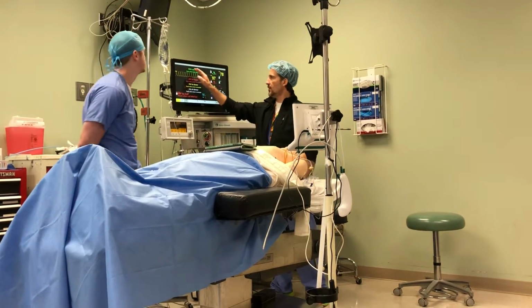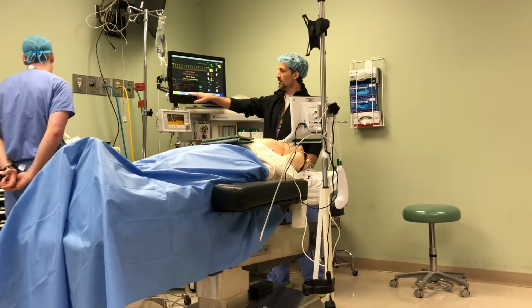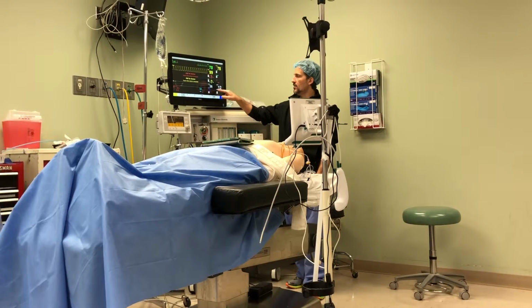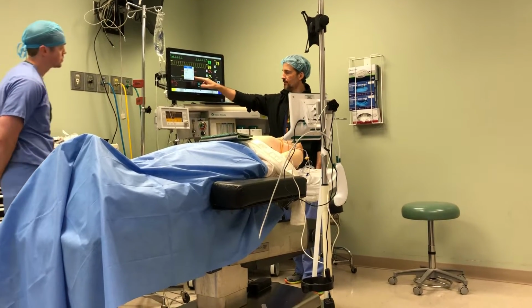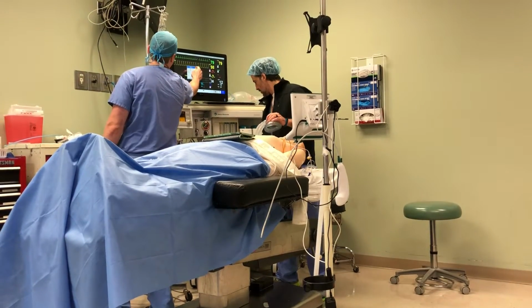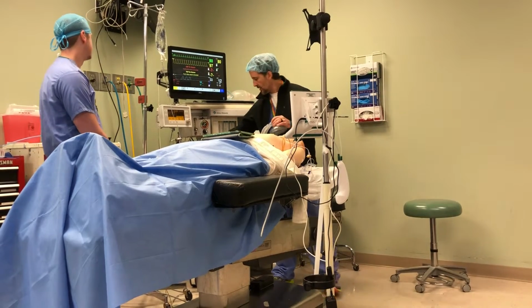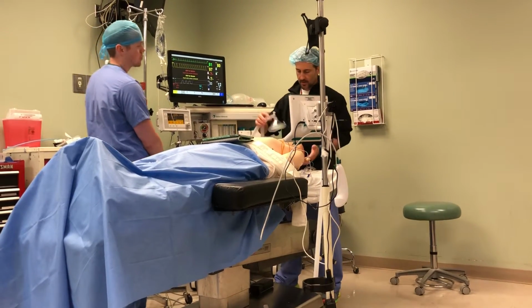So I'm verbalizing, I want EKG, end tidal CO2, I want a blood pressure, and I want end tidal O2. End tidal O2 and on. Gonna give you some oxygen to breathe here. Turn my oxygen up to minimum of 8, so we'll go above 10. Make sure my APL valve is open, so it's on minimum.